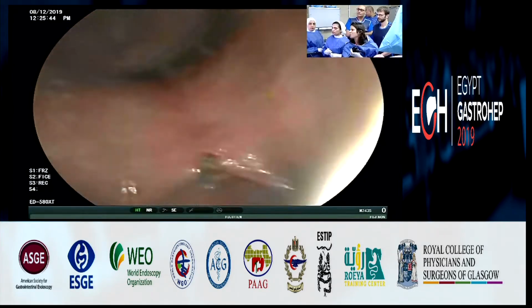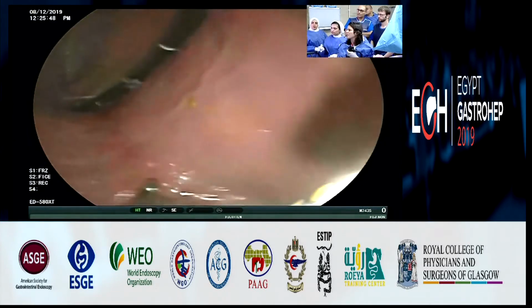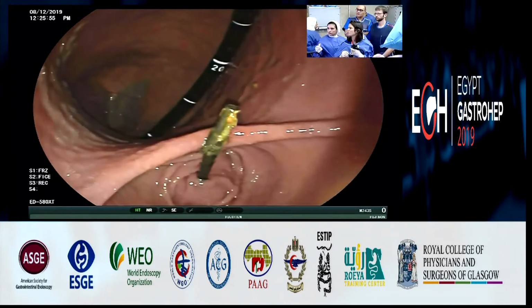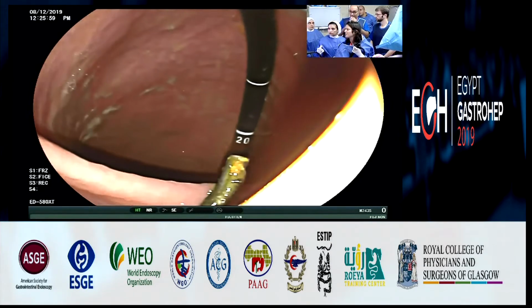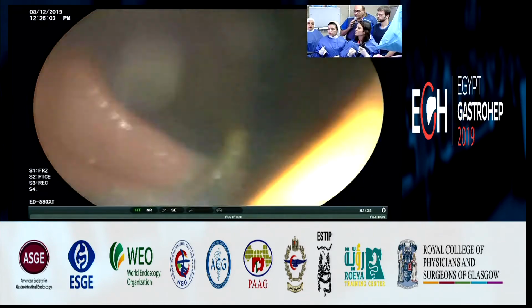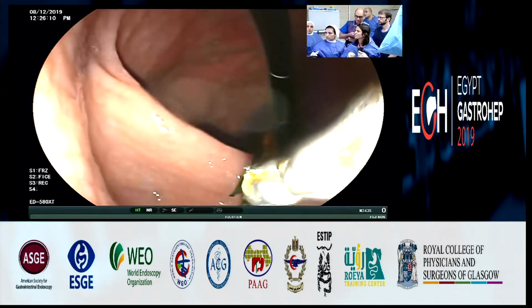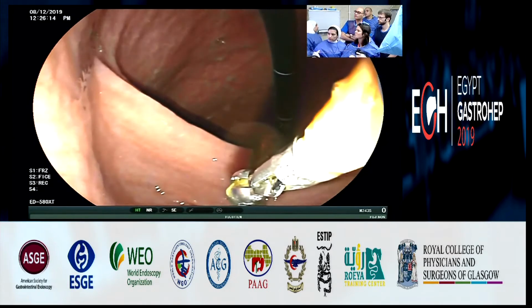We're talking about the different possibilities of diagnosis here because Dr. Mohammed described that there was a persistent stricture. Stricture, Dr. Mohammed, you were saying? It's attenuation. I can't delineate a definite stricture. So it's just attenuation of the intrahepatic ducts, on the left, right? Mainly to the left. Yeah, you're open. Yeah, you can open.